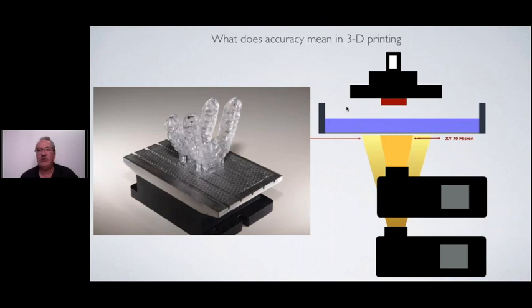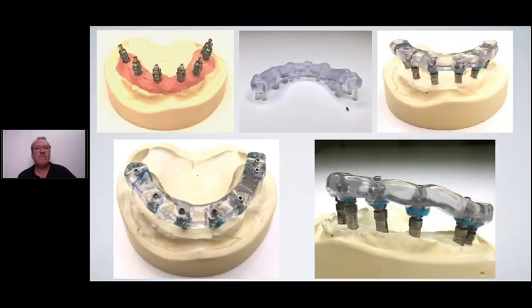That has no issue. So what can we print? We print jigs like you see here for checking the implants, to see if the implants are fitting. If it would not fit, the dentist could cut this, fix them out, and make a new impression over it.